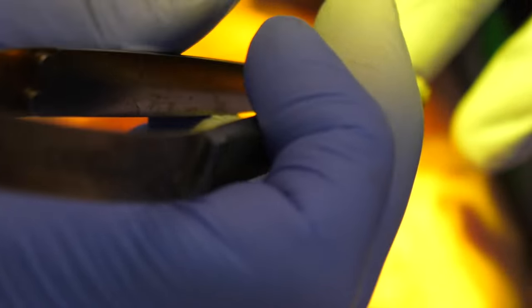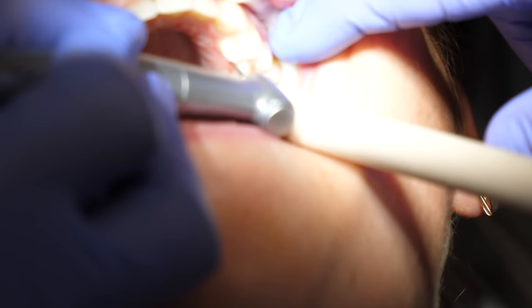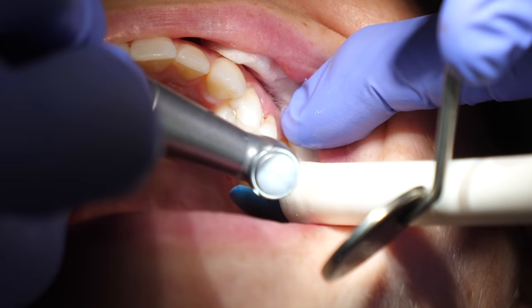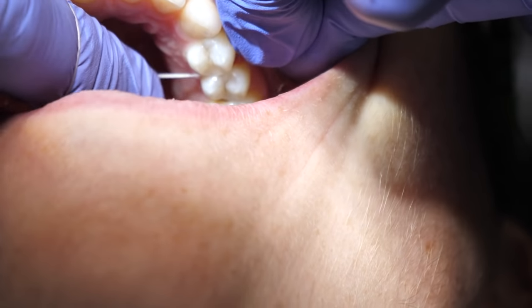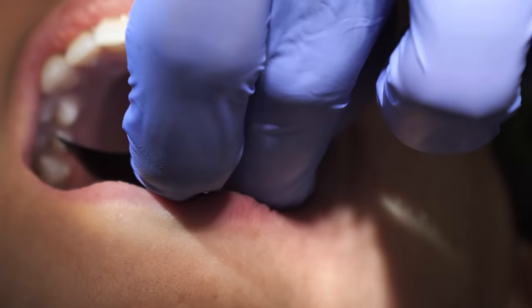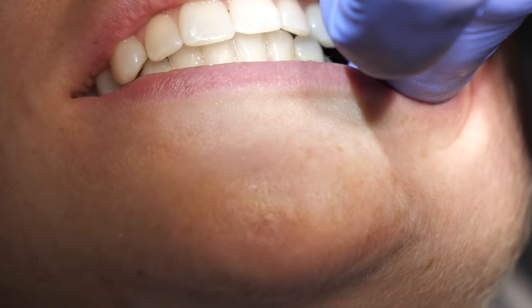Once they are done with the filling material, they'll take off all the wedges, bands, and clamps around your tooth. And with a high speed again, they may remove any sharp edges. Then they may floss it to make sure the contact between the two teeth is good. And lastly, they may check the bite with the biting paper, also called articulating paper.